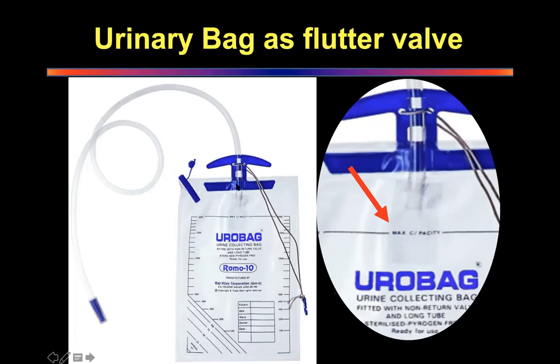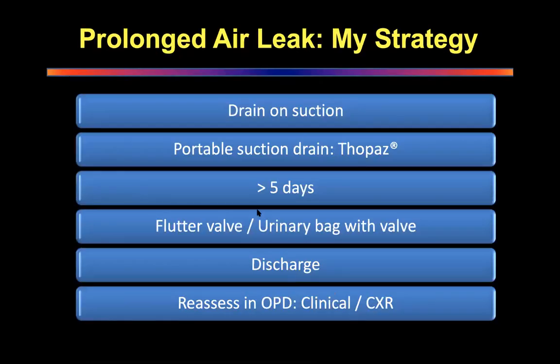But the real reason why you use this is to allow the air to come out, okay? So this is a very good tool as a flutter valve in patients. So this is my strategy. Now look at how I deal with this.